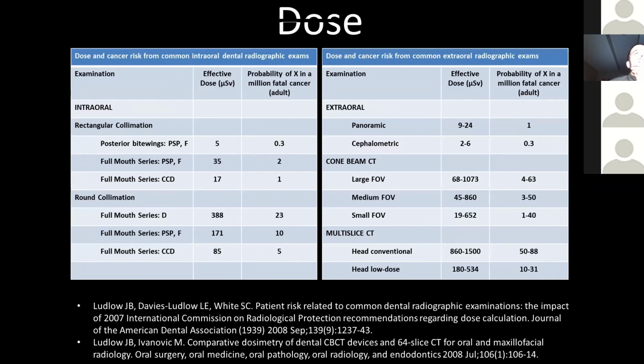I'd have to look up, and I don't have the available numbers right now. I do know there are accessory canals that are much thinner than a cone beam CT can see, to answer your question in a qualitative way. In terms of a measurement, you're not going to get, in theory, better than the nominal or best resolution of the cone beam CT. So that might be 0.07 millimeters as a minimum. We really can't, in theory, get any better than that.